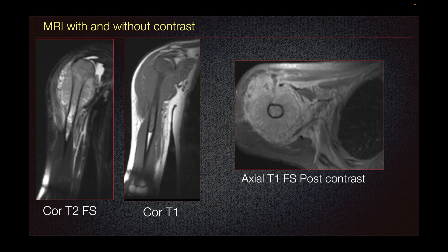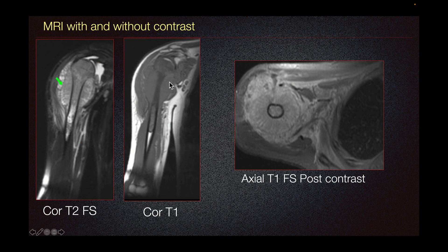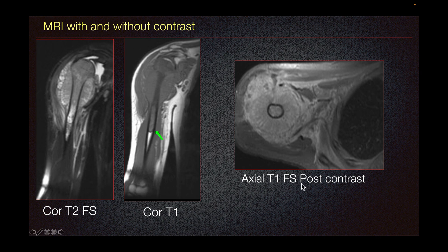On MRI with and without contrast of this patient, here on our proximal humerus, we can see a heterogeneous T2 hyperintense lesion with some soft tissue component, also seen on our coronal T1 imaging. There is bone marrow edema distally and some bone marrow signal abnormality on coronal T1. On our axial T1 fat sat post-contrast imaging, we can see heterogeneous enhancement of this lesion and also of the surrounding soft tissue, concerning for involvement.